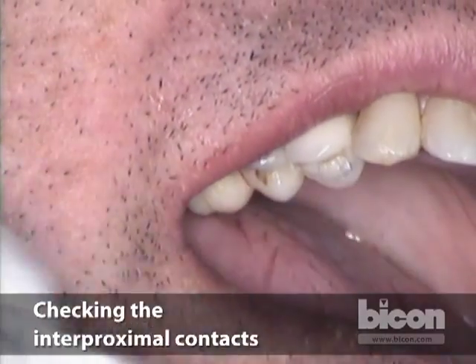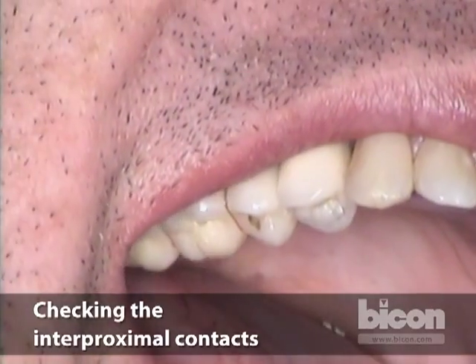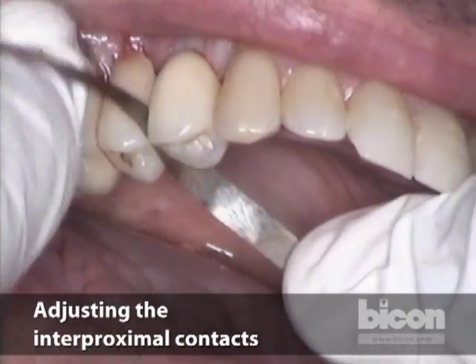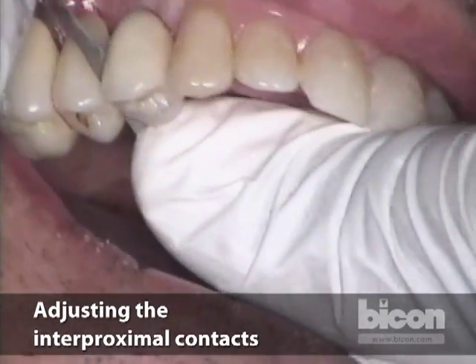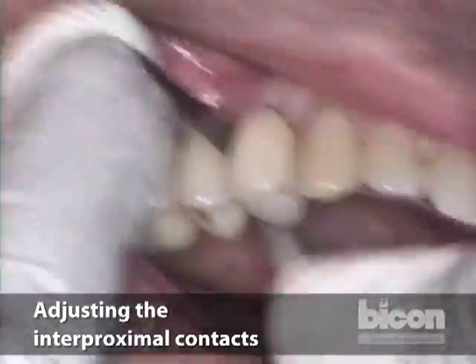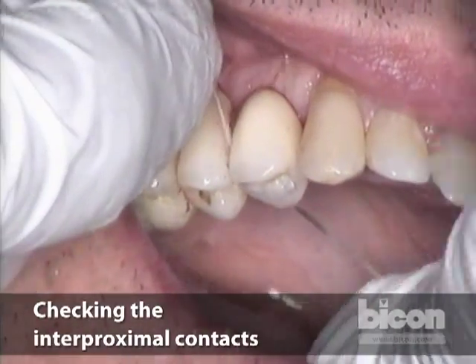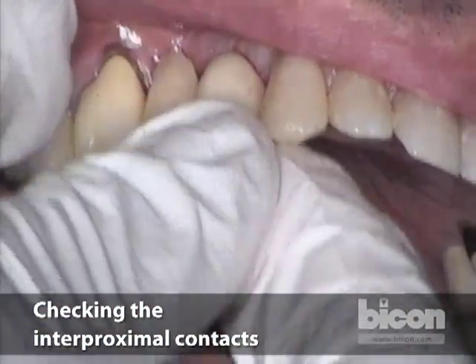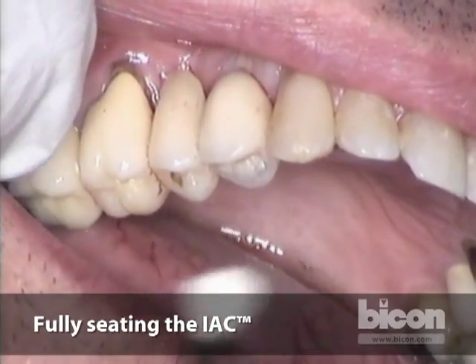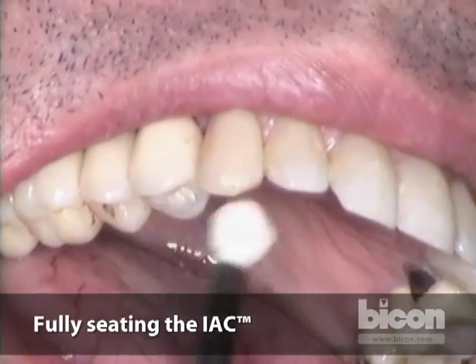Then we check interproximal contact one more time — it remains a little tight, so I go a little bit more. As you can see, it's very easy — you can do it as many times as needed until you get the perfect interproximal contact. I'm going to tap a little bit more just to make sure, in case the tight interproximal contact didn't allow the crown to go all the way down. I tap one final time.